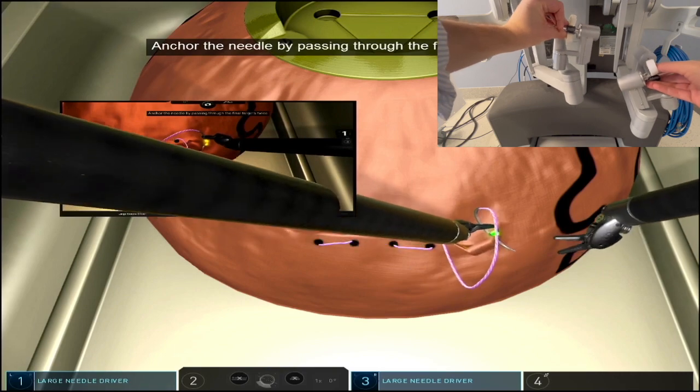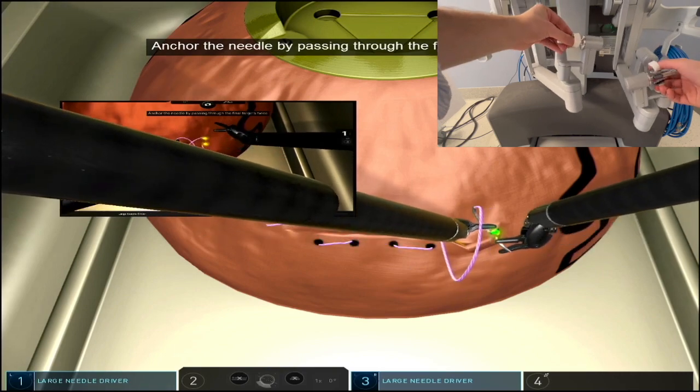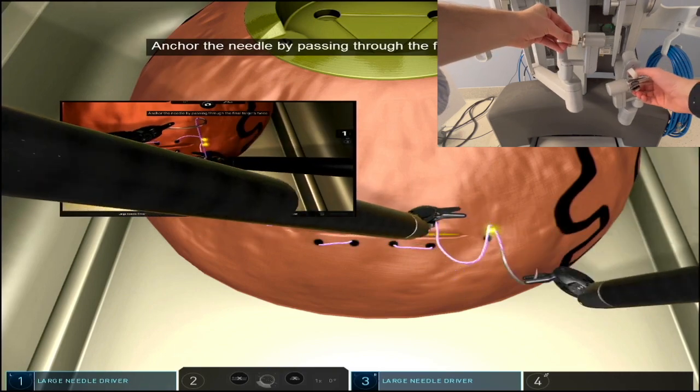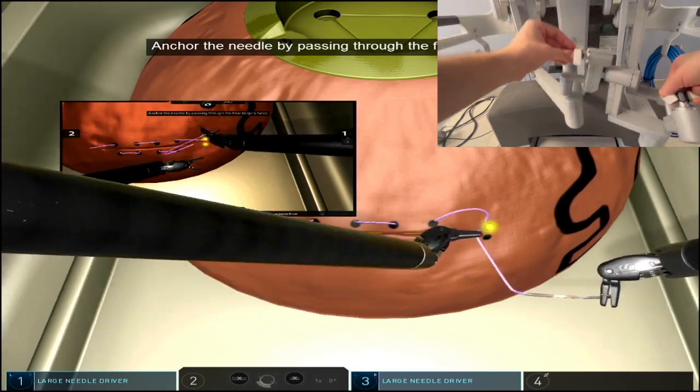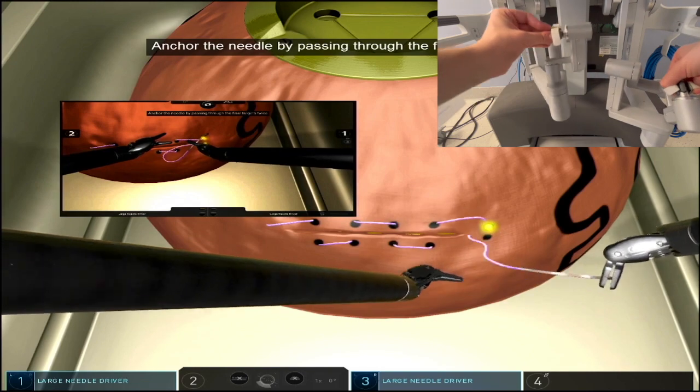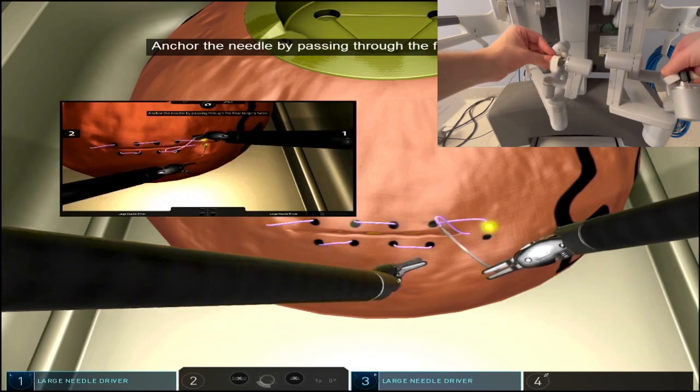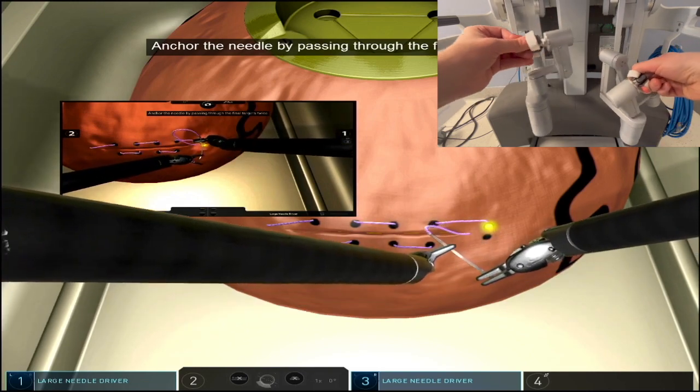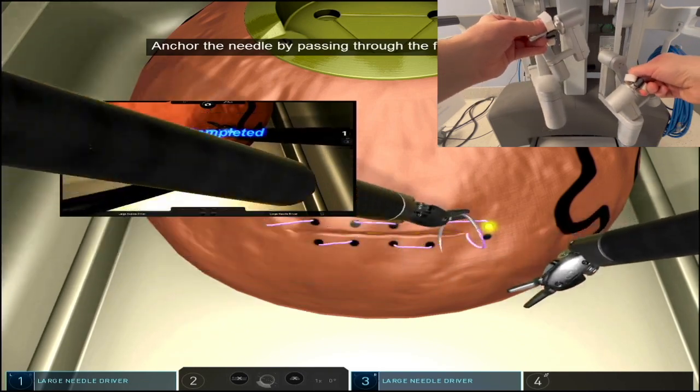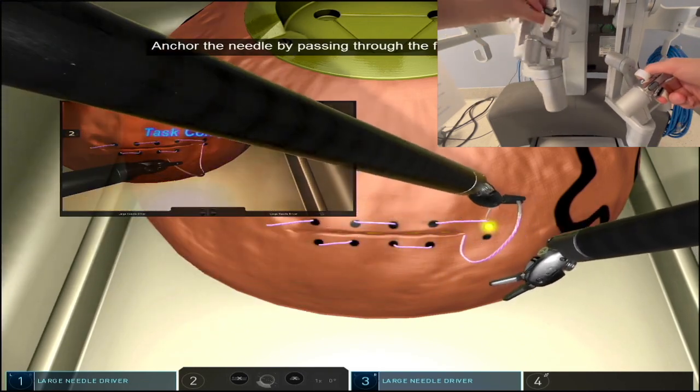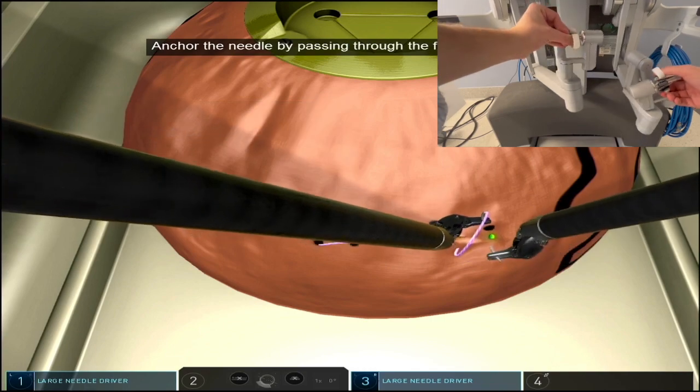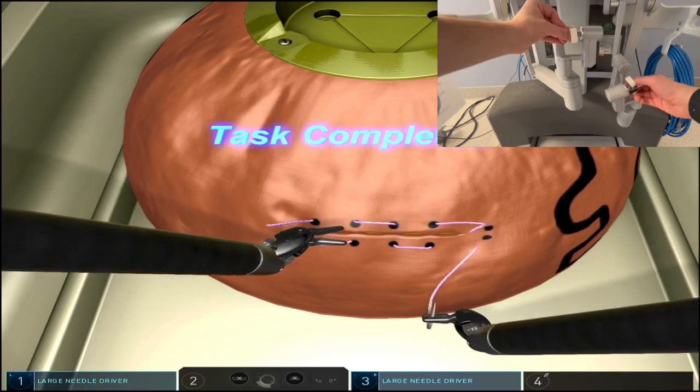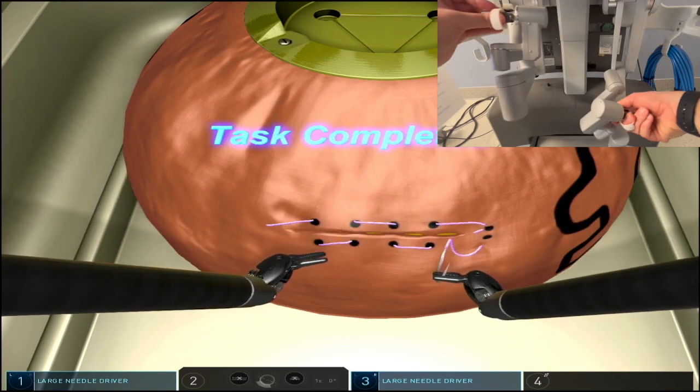When taking bites from proximal to distal, it's easier to take both bites in one go when you're pronating your hand, as you can see in the screen. The final two bites are in this sort of interrupted manner—just take the bites wherever it's going to count them as being correct.